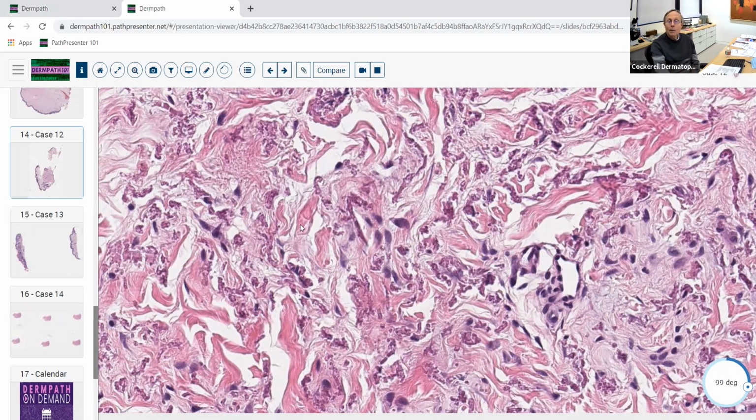But the other stain you can do here is von Kossa stain to stain the calcium, and it will light up the little calcium granules on these elastic fibers quite nicely. So this is PXE, pseudoxanthoma elasticum. It's an autosomal dominant disorder. The last time I checked, if you want to double check me and make sure it's not autosomal recessive, and I'm pretty sure it's autosomal dominant. And they get these atrophic scar-like areas on their skin, and you biopsy and it looks like this.